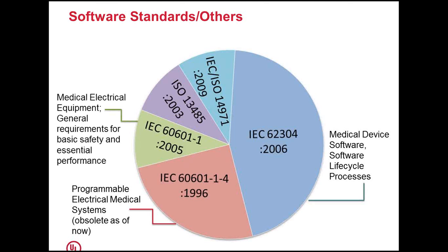So you see, we were discussing software which plays an important role in the safety of the medical device and also in its essential performance. So under one particular subsection of this standard 60601, detailed requirements are given on software development processes, which is again linked to IEC 62304.